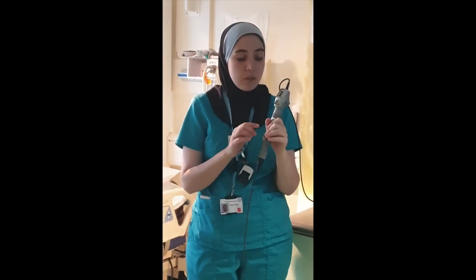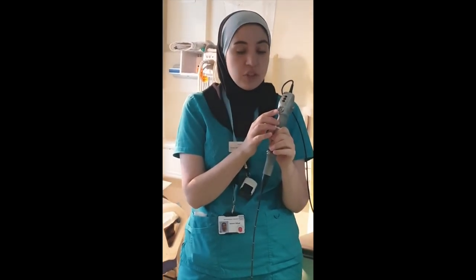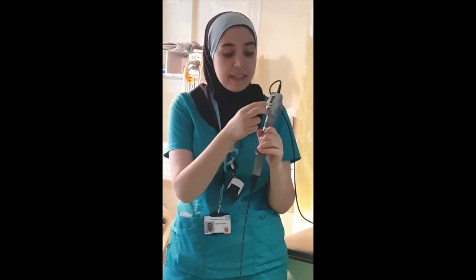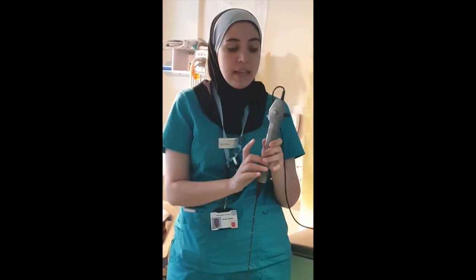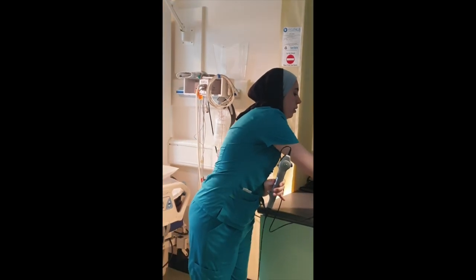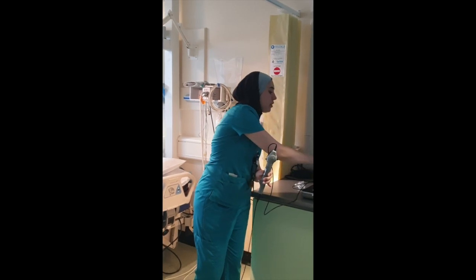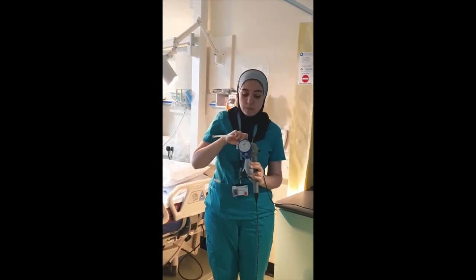Okay. So the first port here is called the suction valve, and normally it has a connection here, which I don't have. And here you've got the suction cylinder. On the side here, as you can see, there is a connection for the leak tester. And as you can see, the leak tester is over here, and this is what you would use to do that.